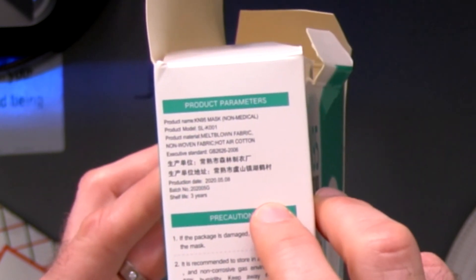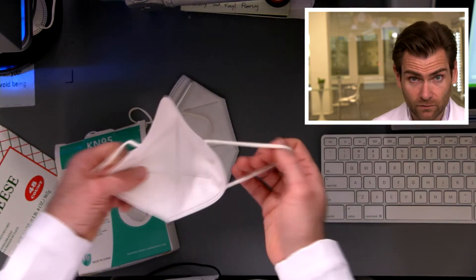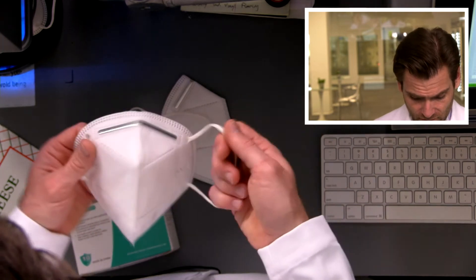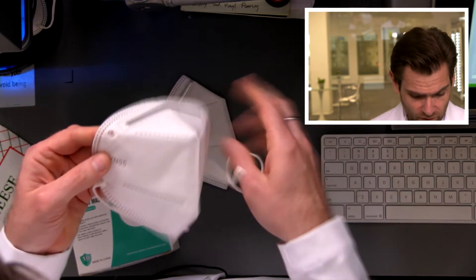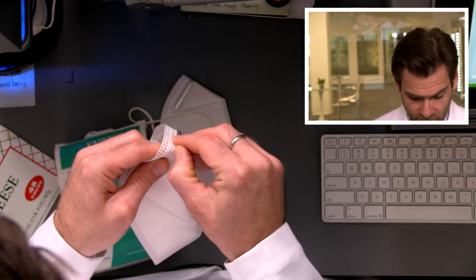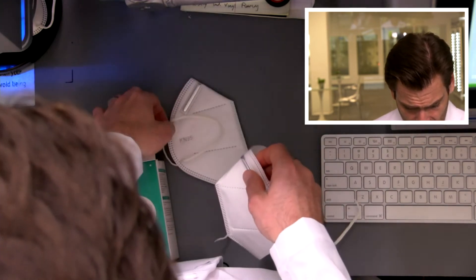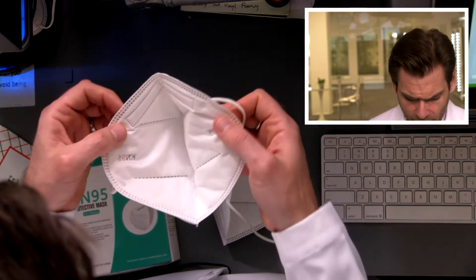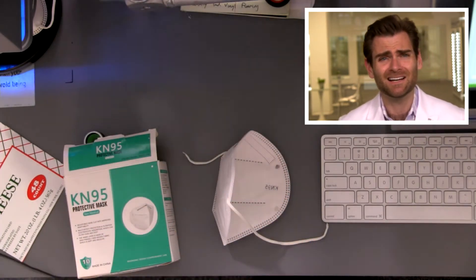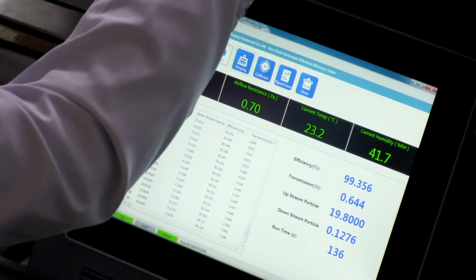It could be that the name of the company is there and we're just missing it — it's got a batch number and production date. Pretty standard design if you look at it. Ear loops — not good. A lot of KN95s, it's really hard to get the welds right there; a lot of times they come off. That's pretty good though, not bad. This was an open package so testing the smell isn't really fair in this case. It's a pretty good quality mask.